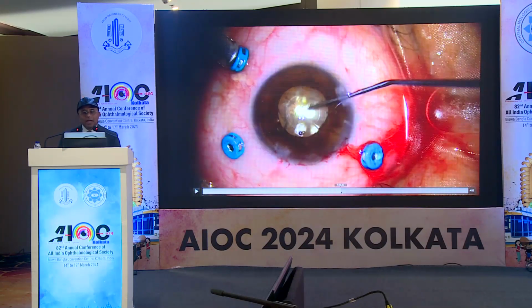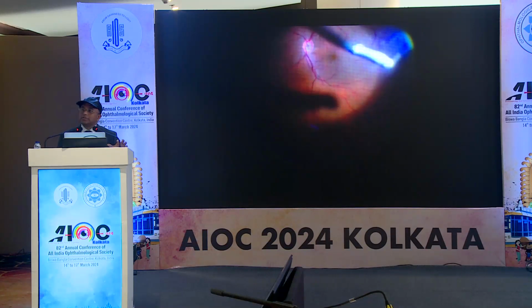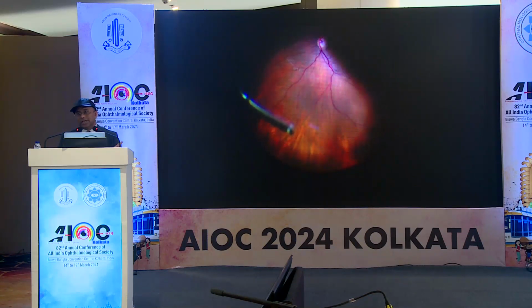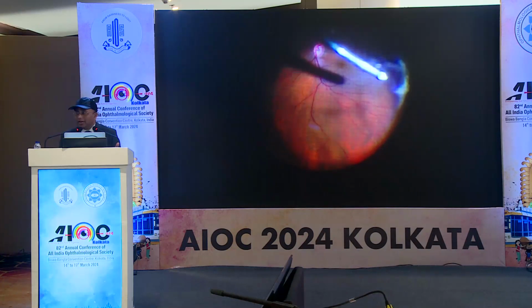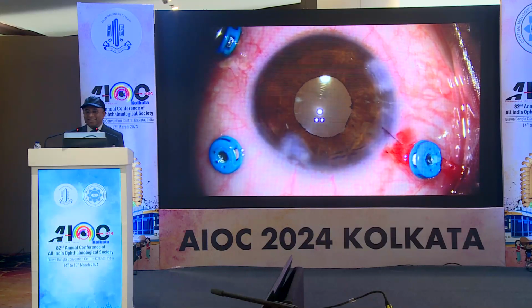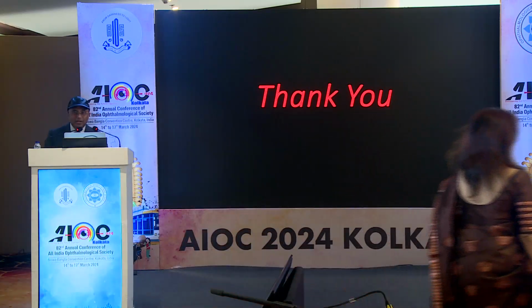For lack of time, I'll just show you that it was done properly aligned, and after the optic capture it was pretty stable. Almost a year now, he had come for a checkup, and he's still maintaining 6/9 and 6/6. The other eye is 6/6 unaided. But yes, we still apprehend there may be complications later, but he is very happy. So optimum outcome could be different in tricky situations. Each patient has to be customized for their demand and need. Thank you.